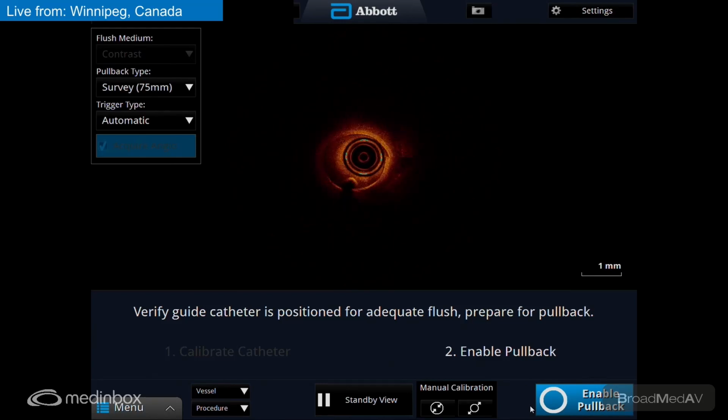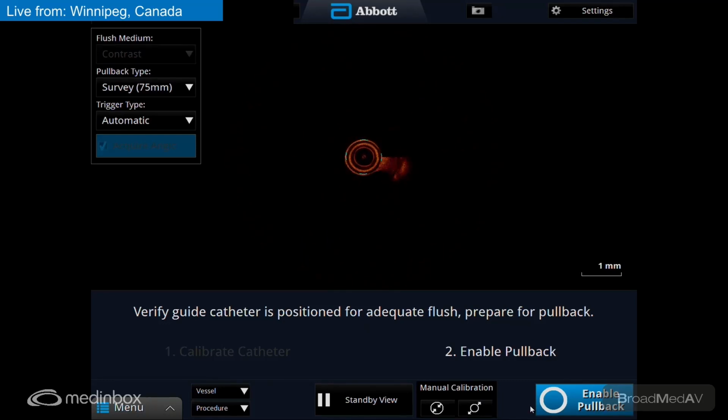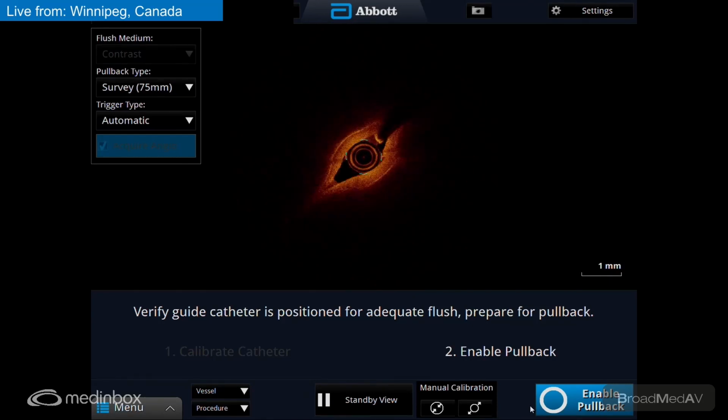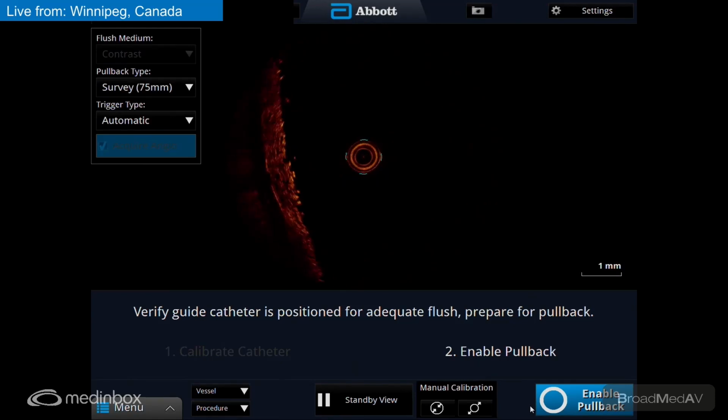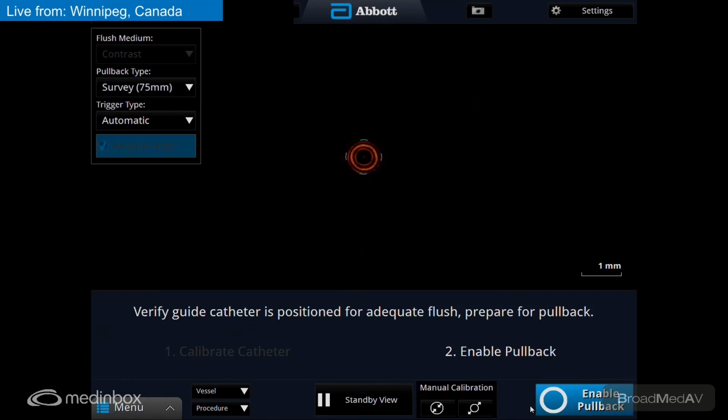I have to inch this in with the 3.5 NC again. Yeah, I don't want to damage this, pushing it too hard. Let's go back to our working view. Recall 2. What about going with a smaller guideliner? I don't think it's going to change your interaction much. I know. It's like an acute bend.